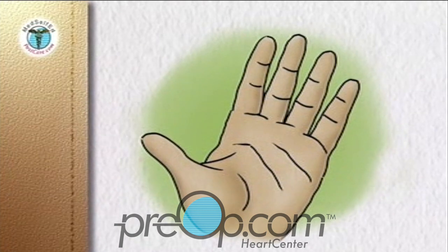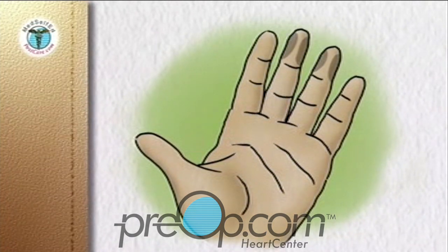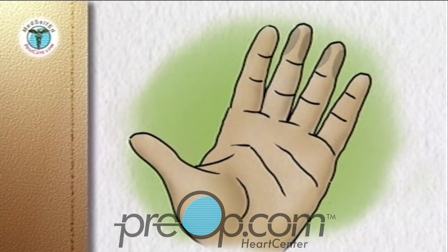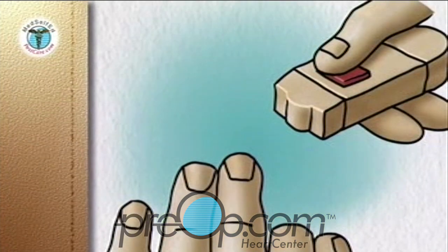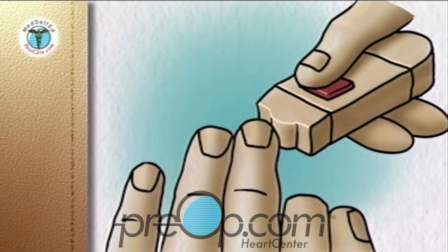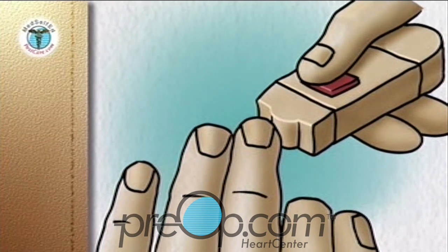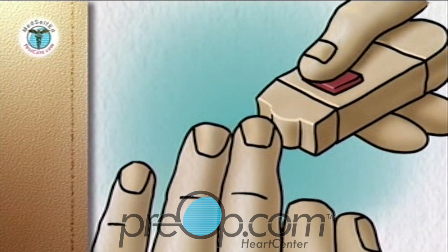Choose your puncture site. The sides of the end segment of the finger are the best sites. Stroke down the finger to push blood toward the puncture site. Place the end cap firmly against the chosen puncture site on the side of the fingertip. The more pressure you use, the deeper the puncture. Push the lancet release button without moving your finger or the device.